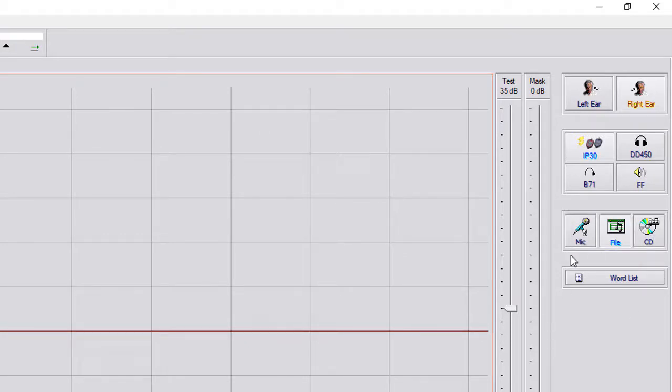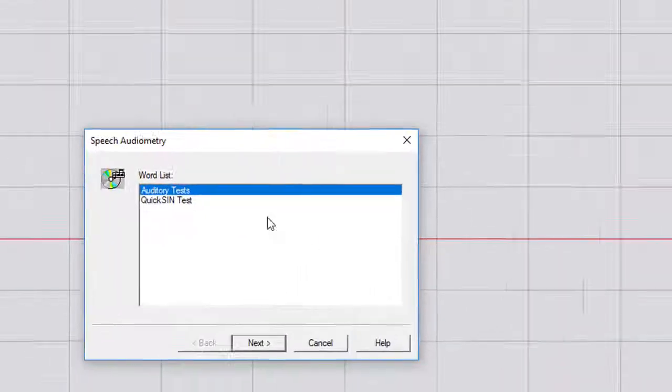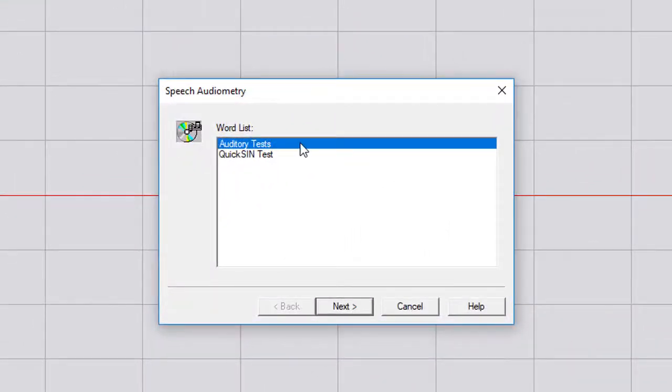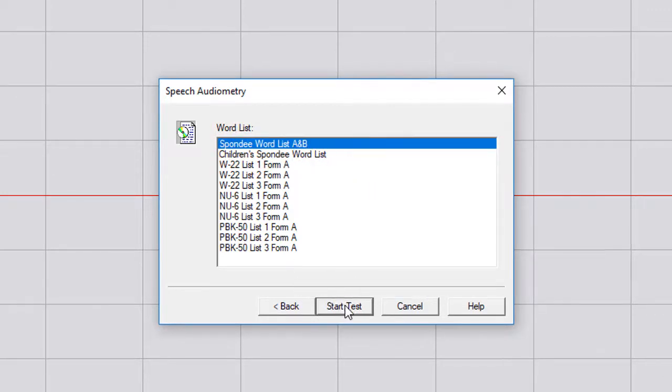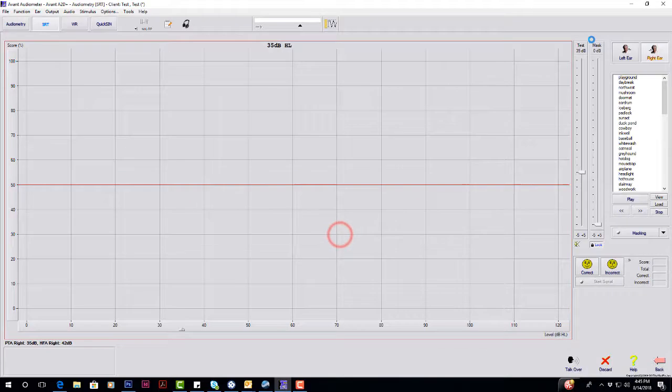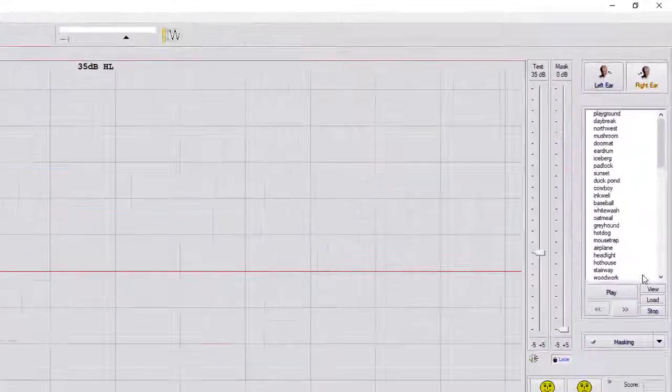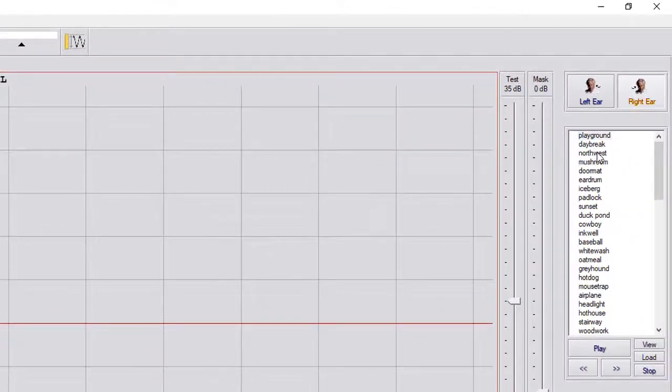Go to Word List here. Under Auditory Tests, you have your Spondy Word List A and B or Child Spondy Word List. All you have to do is hit Start. And on the right hand side, you've got your Word List here.